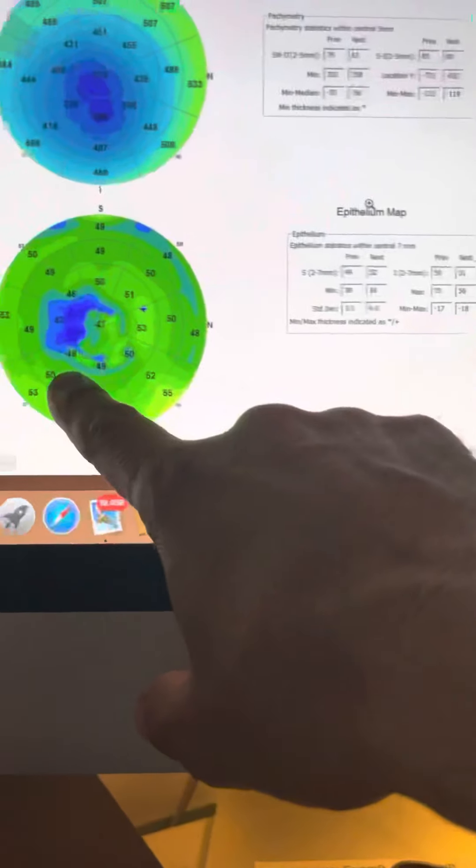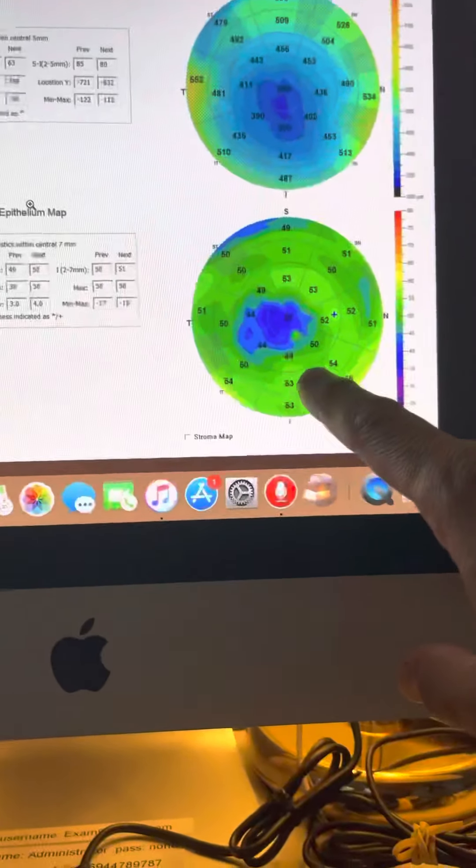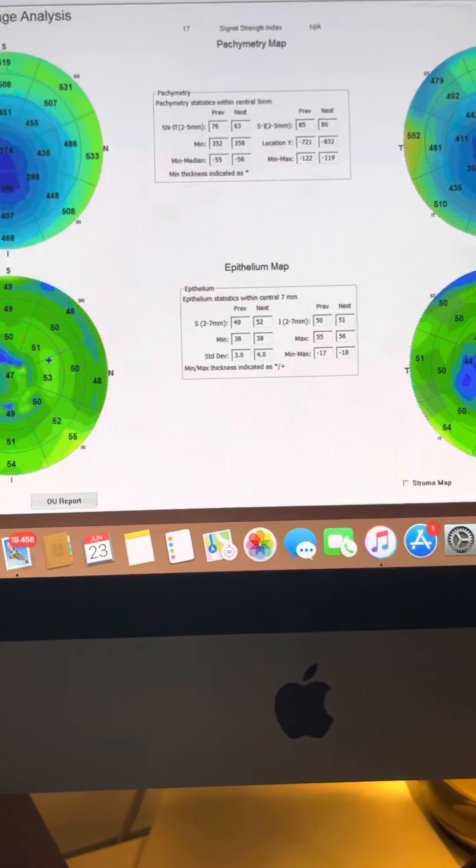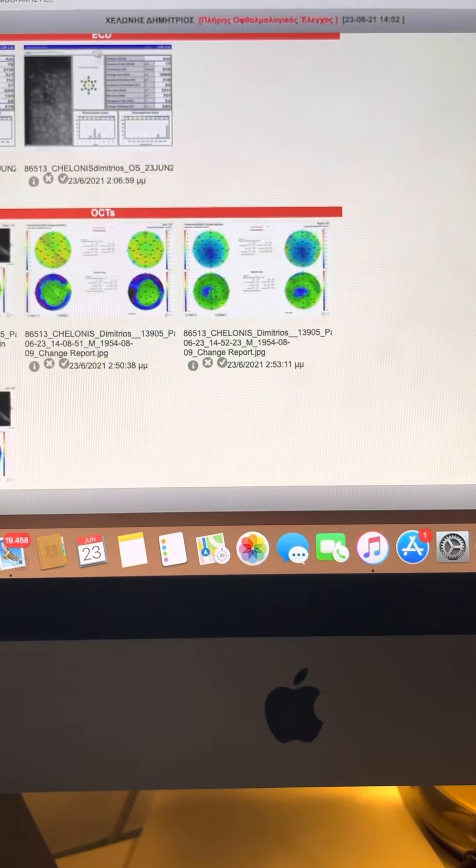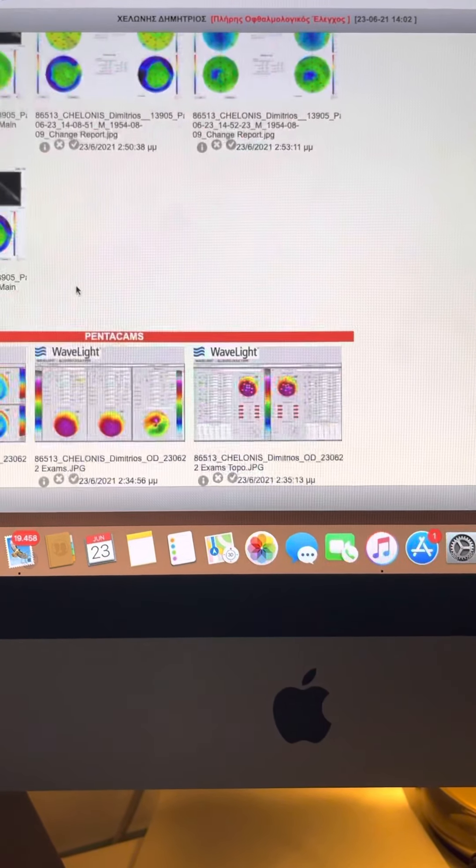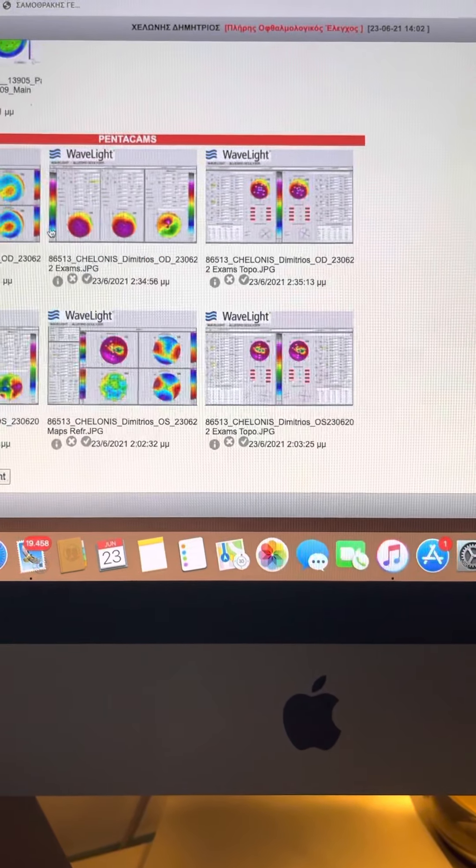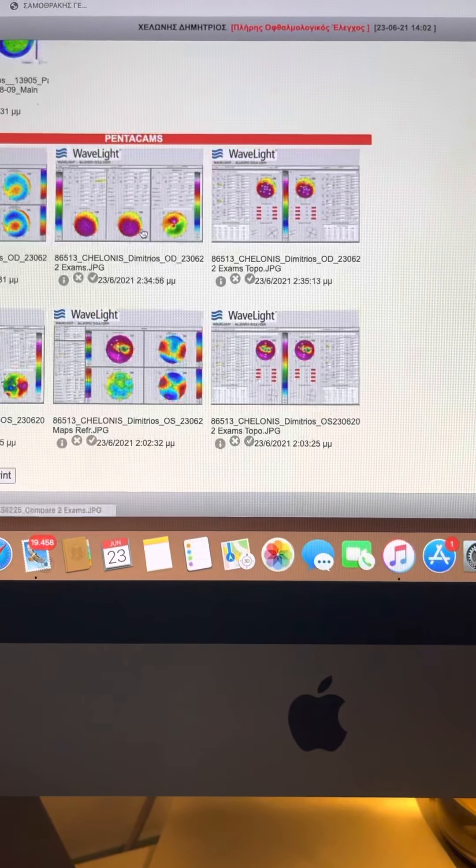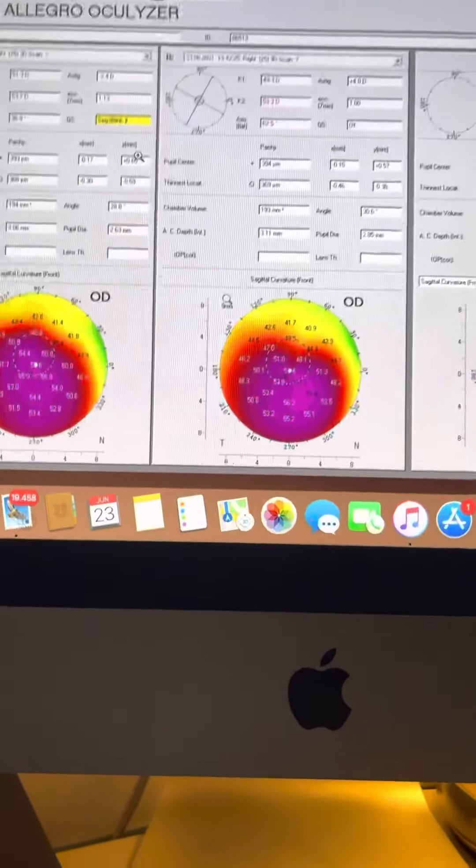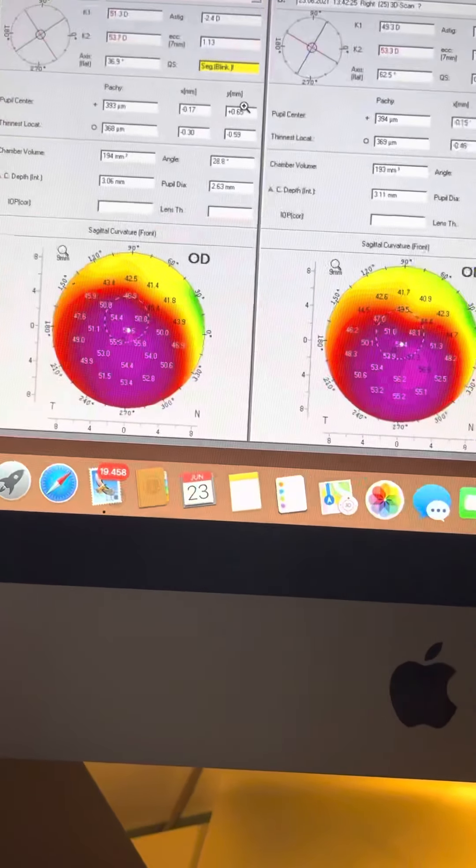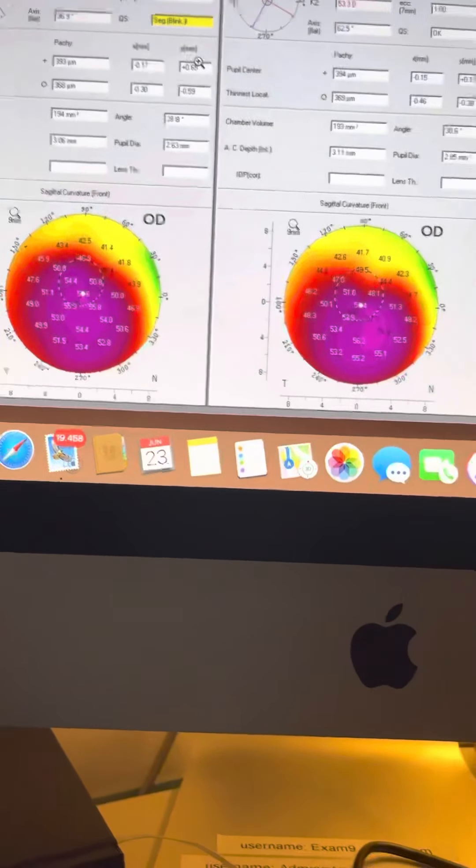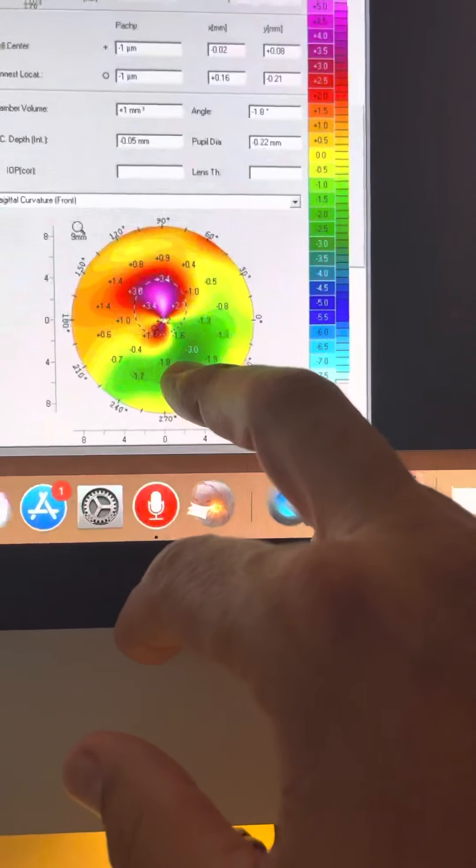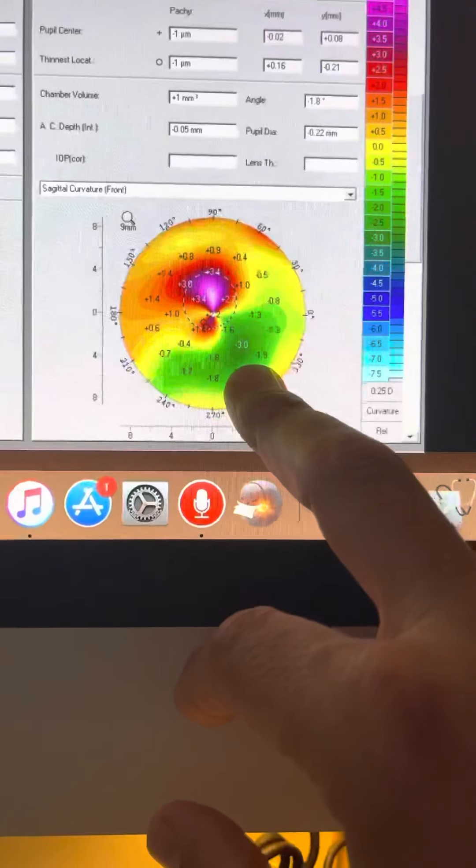This is the OptiView Avanti. This is very important information because on Pentacam, the actual right eye shows a curvature worsening of a significant amount, about three diopters.